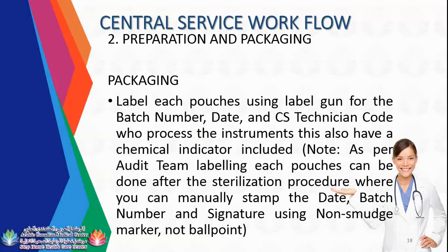Pouches can be labeled after the sterilization procedure, where you can manually stamp the date, batch number, and signature using a non-smudge marker, not a ballpoint pen. A ballpen is not acceptable in labeling pouches because it can penetrate the pouch and damage the integrity of the pouch.